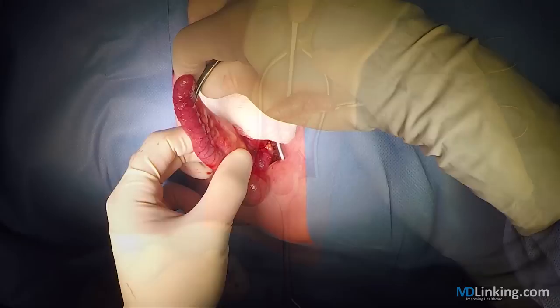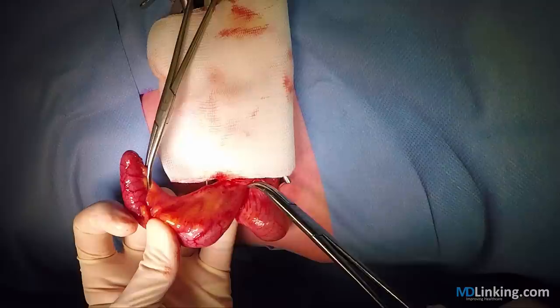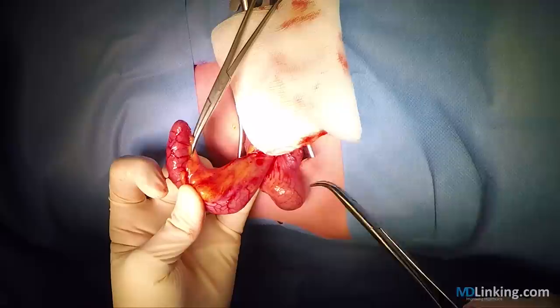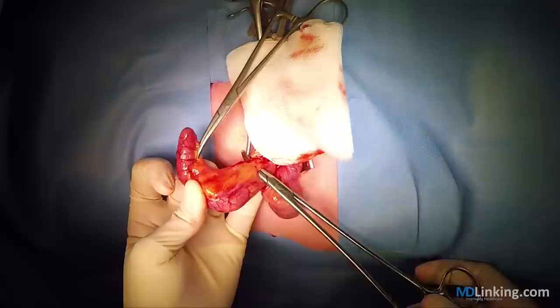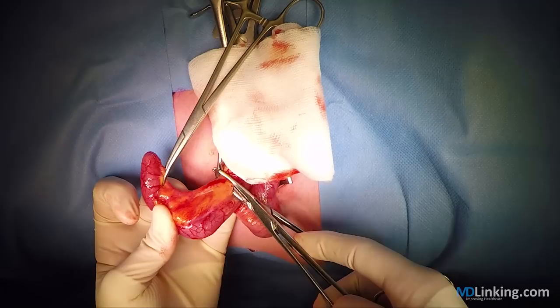We then position a clamp on the distal part of the mesoappendix. We can start identifying the appendix, which you can see here. We try to ligate it at the base so that you only need to have one ligation, and can thereby with only one step divide the mesoappendix.